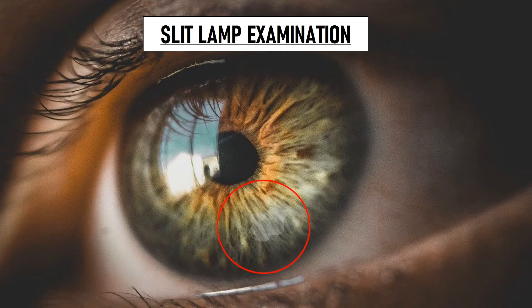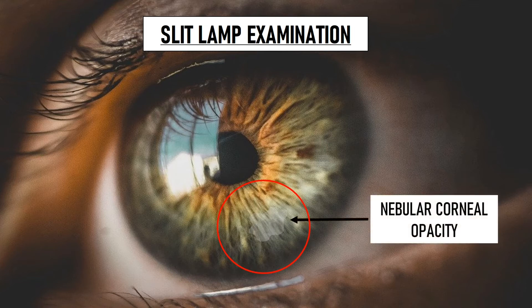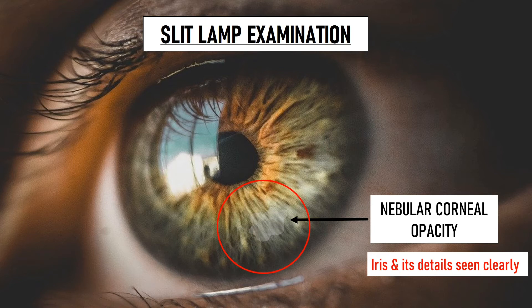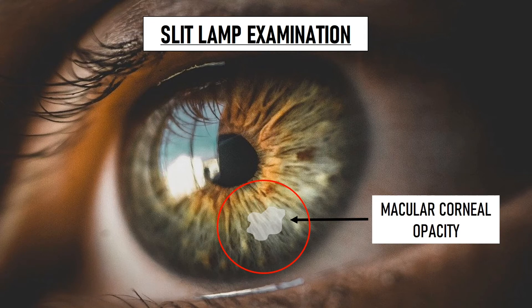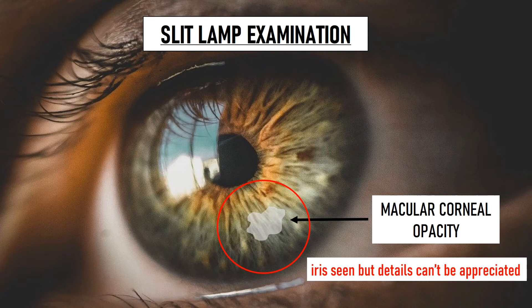To grade an opacity as nebula, we try to visualize the iris behind the opacity. In nebular corneal opacities, the iris can be visualized clearly and we can also appreciate details of the iris surface — such as iris crypts, iris furrows, etc. — very easily. Macular corneal opacities are denser, so on slit lamp examination we will be able to see the iris, but it will not be possible to appreciate the iris details easily.